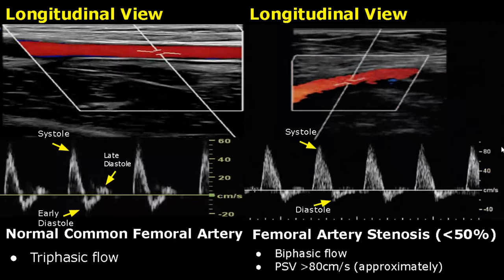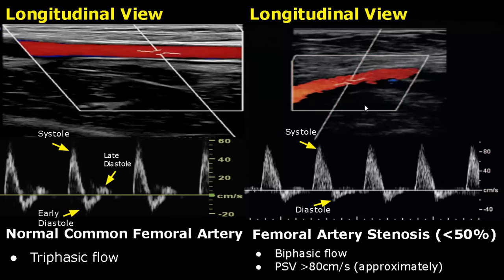Femoral artery stenosis is the abnormal narrowing of the artery. Its main cause is atherosclerosis. There are various degrees of stenosis. In this case, there is less than 50 percent stenosis of the artery. You can see some narrowing of the artery, and the spectral Doppler waveform looks almost normal, but it is a biphasic flow instead of triphasic.